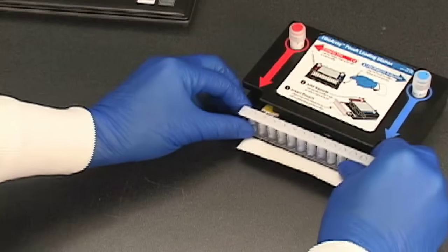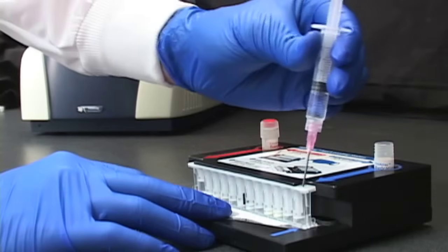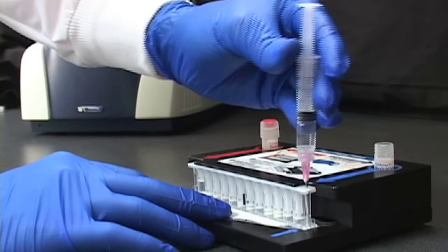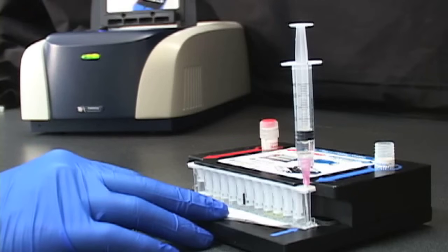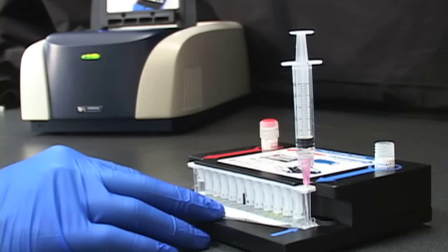To begin a FilmArray run, the pouch is first placed into the loading block. Then, hydration solution is injected into the pouch through the blue inlet port on the right. The vacuum in the FilmArray pouch automatically draws the correct volume, eliminating the need for precise measuring and pipetting.